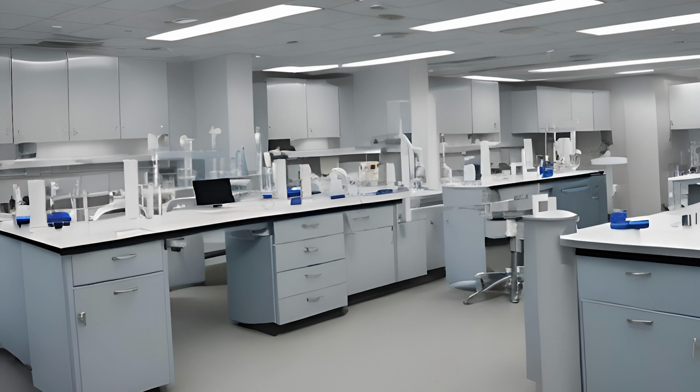Something you can do to help with that is if they have long sleeves on their shirt or you have some type of cloth or something nearby, you can place that over where the tourniquet's going to go, and then you put the tourniquet on top of that sleeve or on top of that piece of fabric so that it doesn't dig into your patient's arm. That'll make it more comfortable for them without interfering with the effectiveness of the tourniquet.